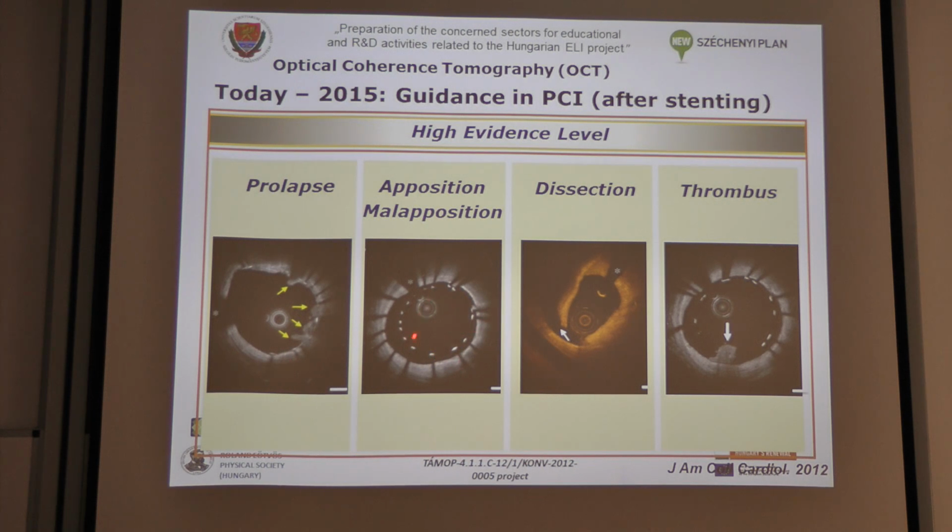You can see that the small metallic little struts, cross section of the elements of these stents, they are not attached to the lumen, and those could be really the spots where, if there is a slow flow in the coronary artery, maybe during the sleeping of the patient, or if there is a prothrombotic status of the patient. So this is really very dangerous.